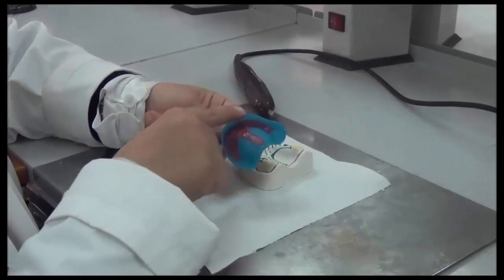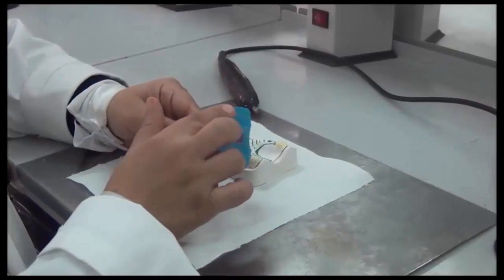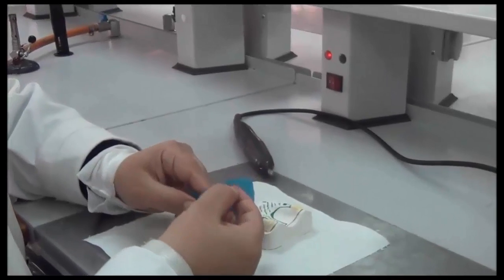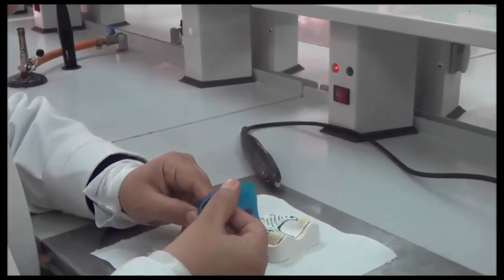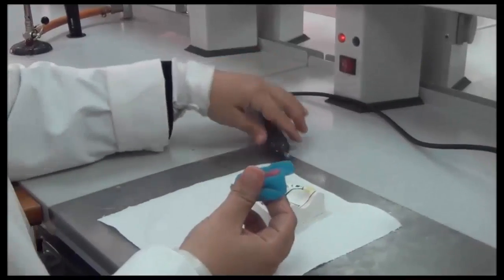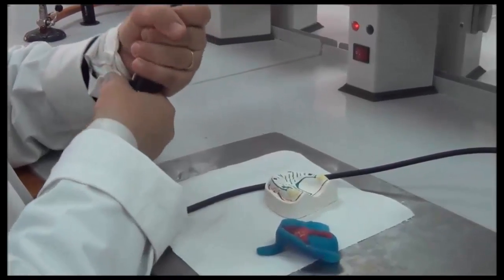Now we're going to trim the borders. Although we have cut the borders to the line we have drawn, the cut itself is sometimes rough, and it produces sharp edges. These sharp edges will traumatize the patient while we're working. So we need to round them out. Not reducing the length, just rounding them out. So we're going to use your handpiece that you have.